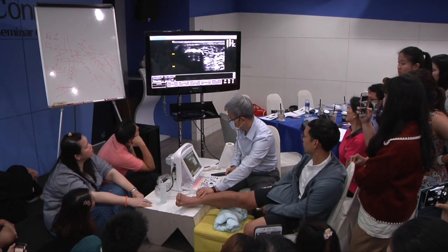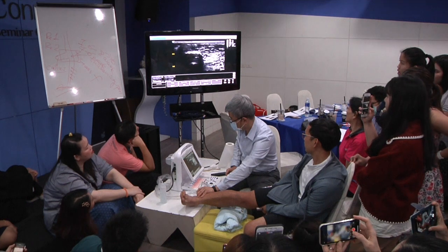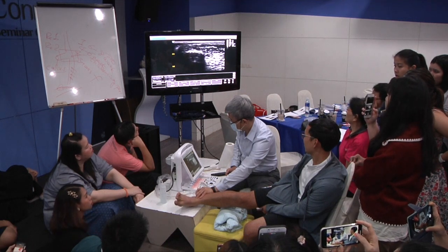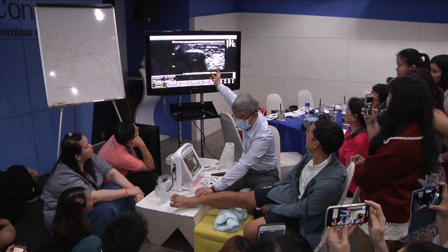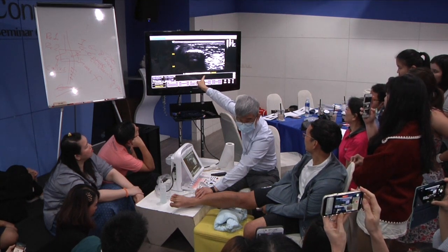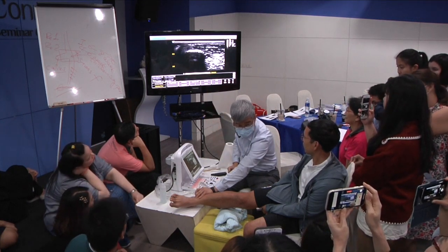Can you do the dorsiflexion slowly for us? More. Okay, relax. And you can see the longus try to move forward to take the place of brevis. Brevis is moving backwards slightly, right? During the dorsiflexion. Do it slowly, not too forceful.